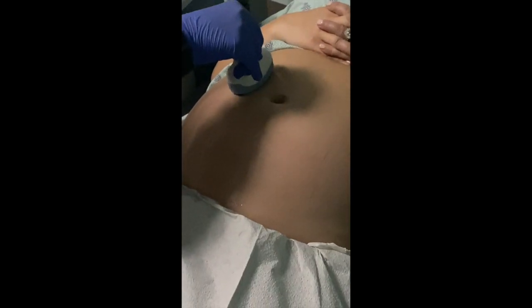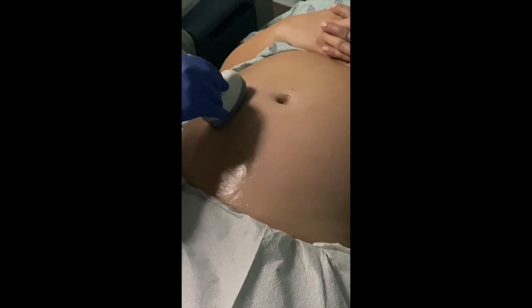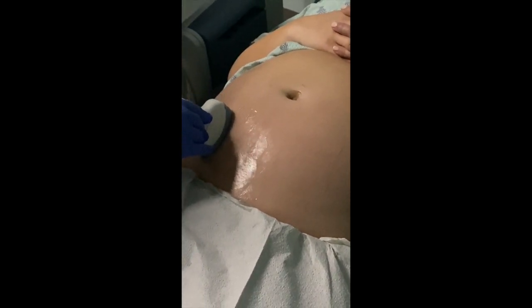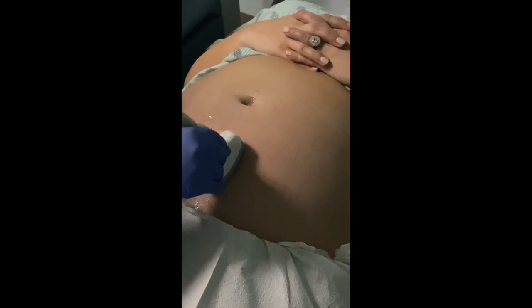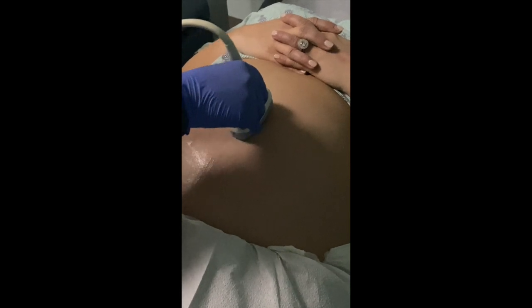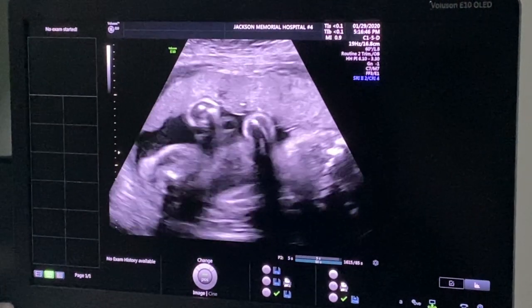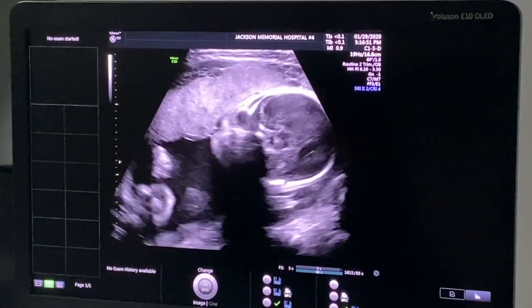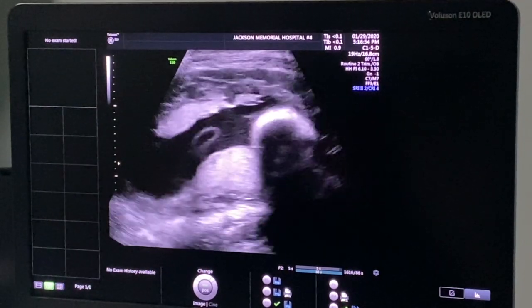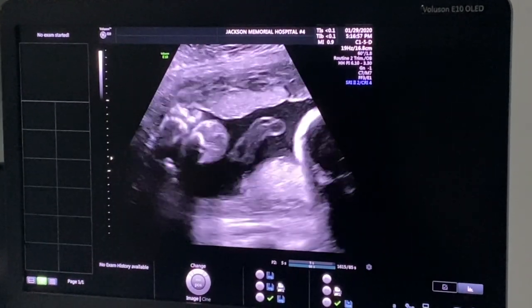To assess the placenta, place the transducer in the sagittal orientation in the right upper abdomen just above the uterine fundus and scan longitudinally downwards towards the right lower abdomen. Repeat this same step along the left. Note that this patient has an anterior placenta. The placenta may be fundal, anterior, posterior, right lateral, or left lateral in location. The lower placental edge should be assessed. If its lower edge is noted to be in the lower uterine segment or near the cervix, a transvaginal ultrasound should be performed to diagnose placenta previa. This is beyond the scope of this video.